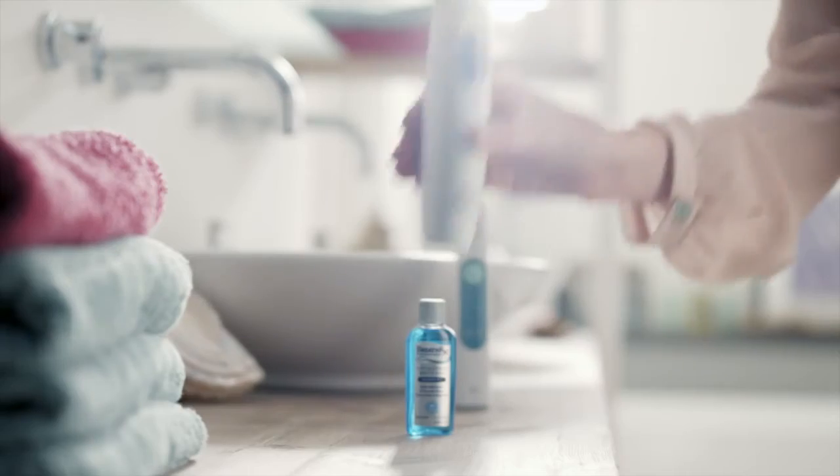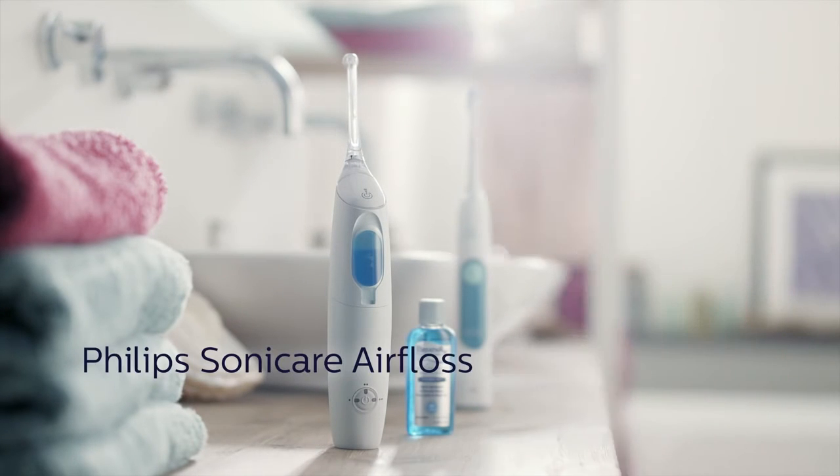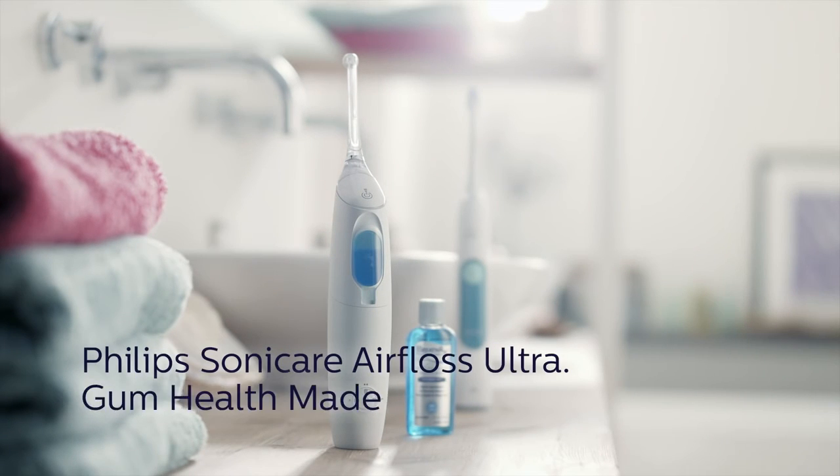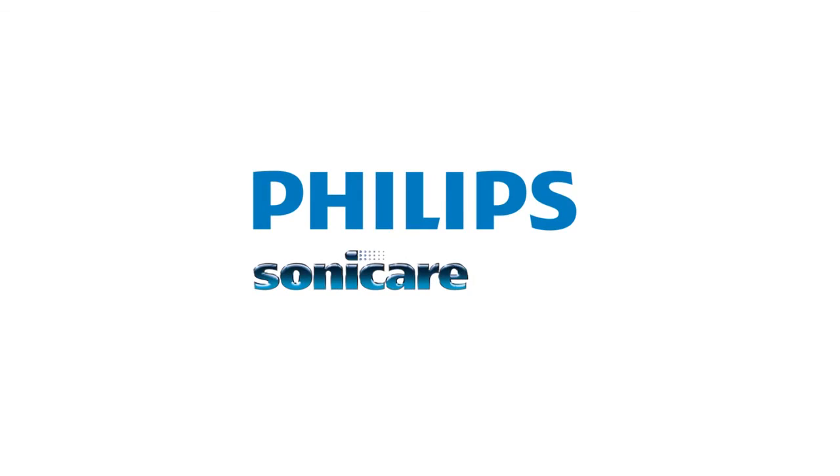Surprise your dental professional on your next checkup with a healthier and more confident smile. Philips Sonicare Air Floss Ultra. Gum health made easy. Innovation and you. Philips Sonicare.